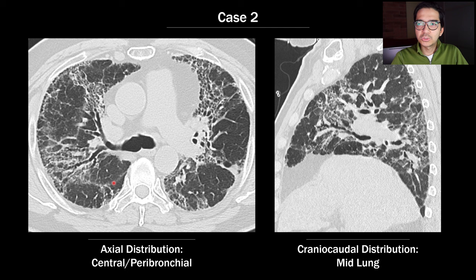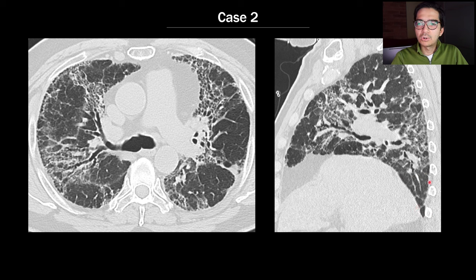In the second case, axial and sagittal images show fibrosis that is central or peribronchial in distribution, with a mid-lung predominant craniocaudal distribution — in fact, the bases are spared. This means the patient has an alternative diagnosis. This patient was diagnosed with chronic hypersensitivity pneumonitis, and had moderate to extensive expiratory air trapping on expiratory images.